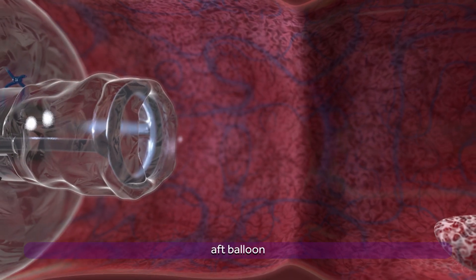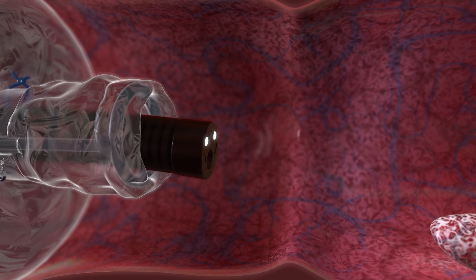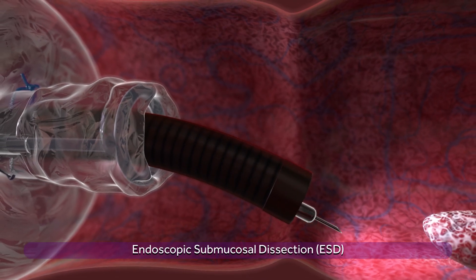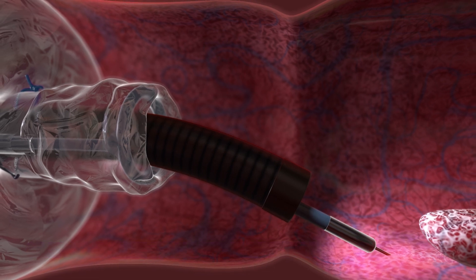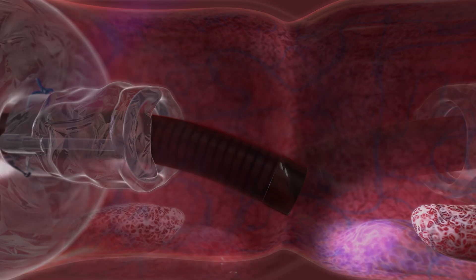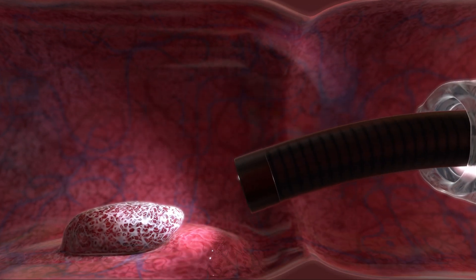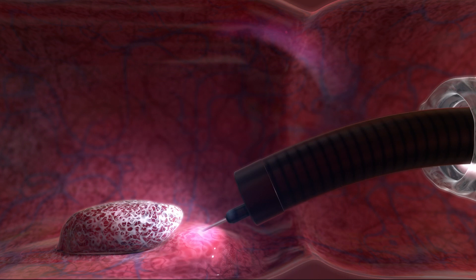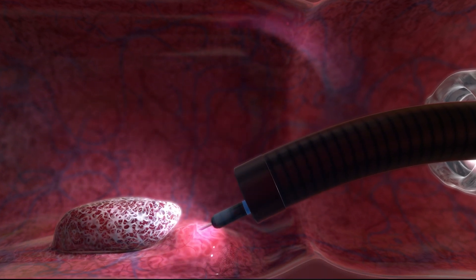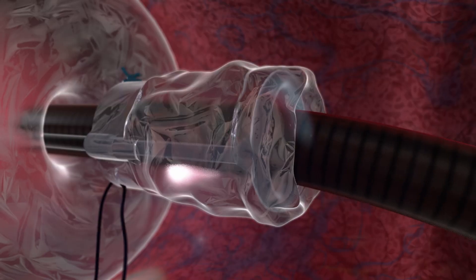With the endoscope and DiLumen in position, the aft balloon is inflated first to stabilize the endoscope inside the colon. When performing endoscopic submucosal dissection, the clinician will begin with a submucosal injection to create a cushion. Dissection then begins by creating an incision between the mucosal and submucosal tissue and continues until a lip between the mucosa and submucosa has been created.